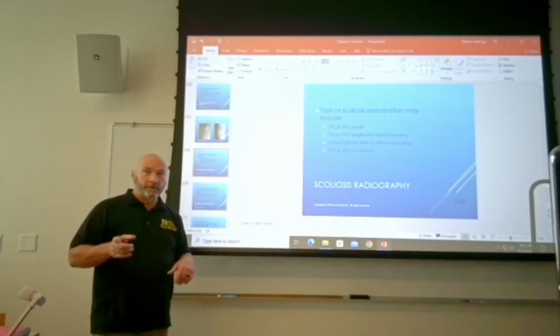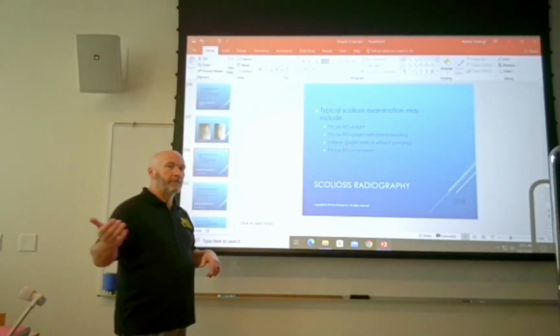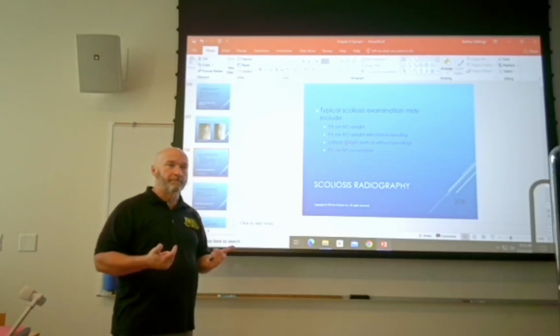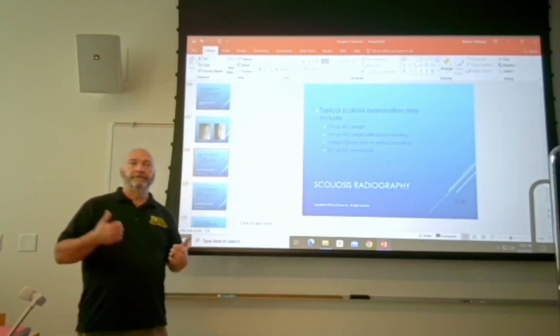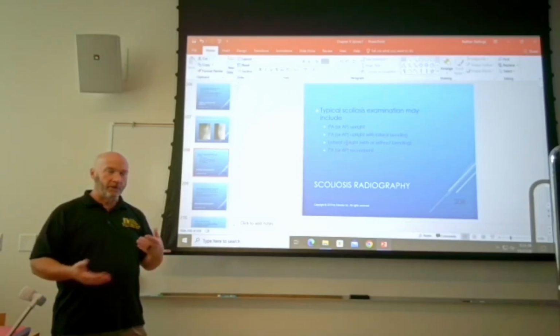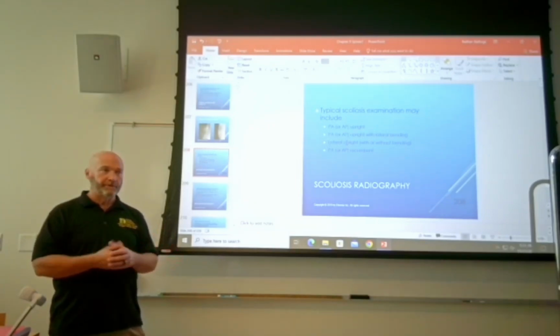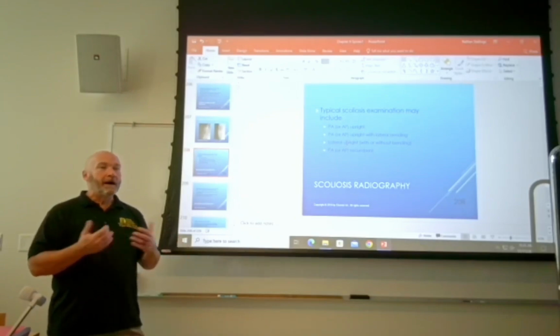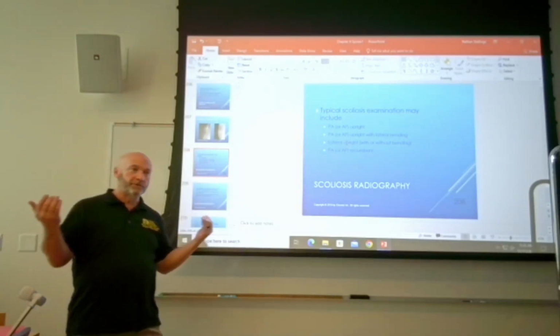We're going to shoot this one, though, at 72 inches, and we're going to shoot a PA. The purpose for the PA is to use the body as a filter, because some of those low energy X-ray photons are just going to absorb inside of the patient's breast tissue anyway. So we're going to shoot PA, and we might also use what they refer to as a trough filter.